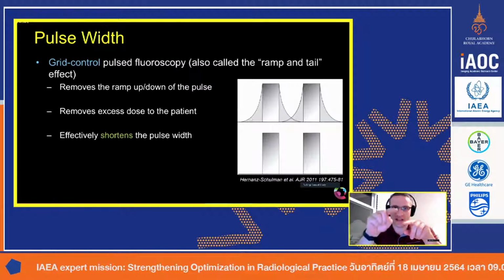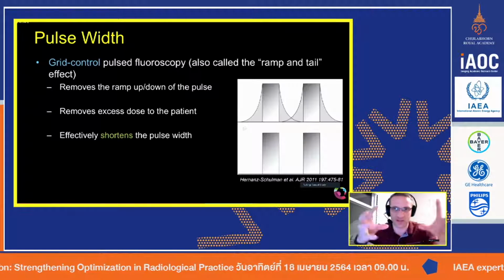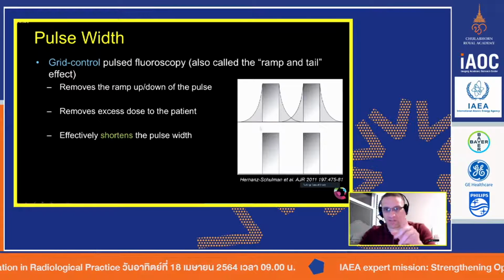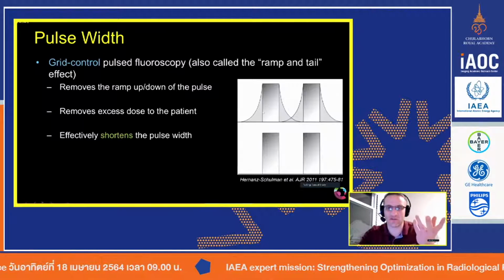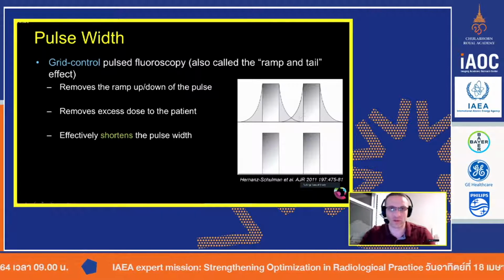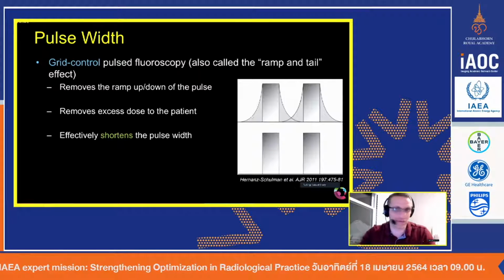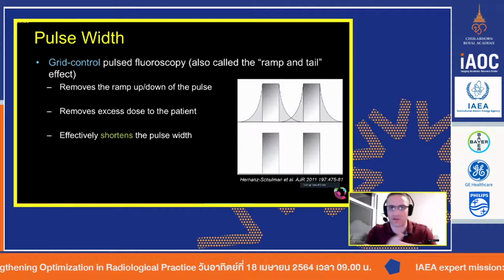Because there's that heating and cooling, heating and cooling, heating and cooling, and so you're pulsing out the signals, you have these tails. Those tails create different energy photons that are in no way, shape, or form good for imaging the body. They're a necessary evil because you have to create them. You just have to have it so the system will turn on to create the X-rays.